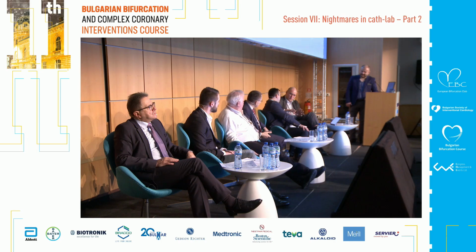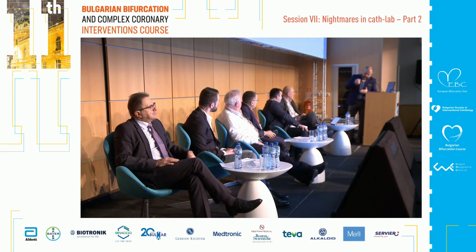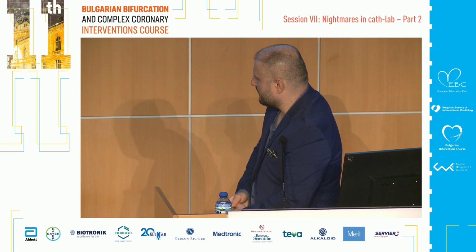Dobry, I want to shy away from the indication point, but I have a technical question. In a situation when your stent is stuck across probably the start of the stent, how far do you go with the snare? So, some tips and tricks, because the snare obviously should go through the strut of the previously implanted stent, or maybe shouldn't. The snare went exactly to the stuck place. Yeah, that's what I saw. And there I caught the stent and was trying to pull it out. The snare didn't go as far down from the stuck place.